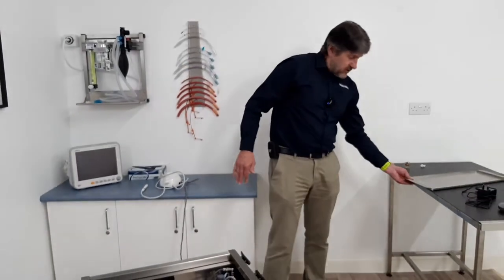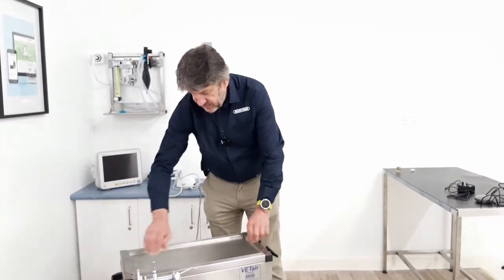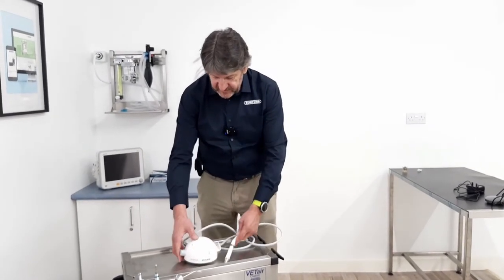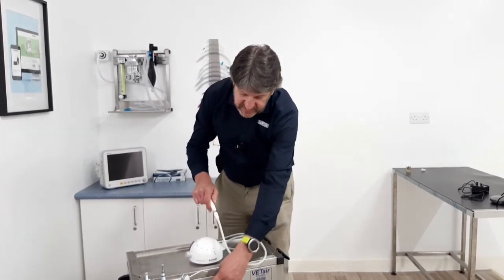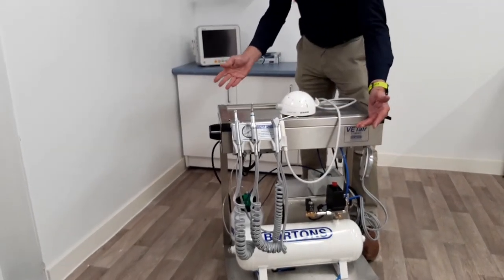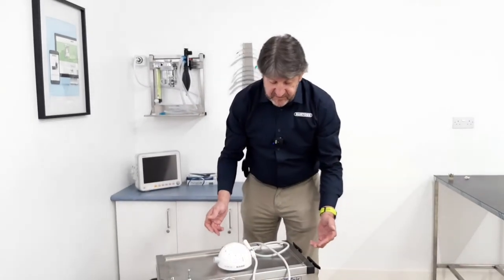We can then reinstall the lid and sit the scaler on top. On the side of the machine you will see there is a convenient place to put the scaler handle; however, if you prefer, there is also one on the body of the machine itself.